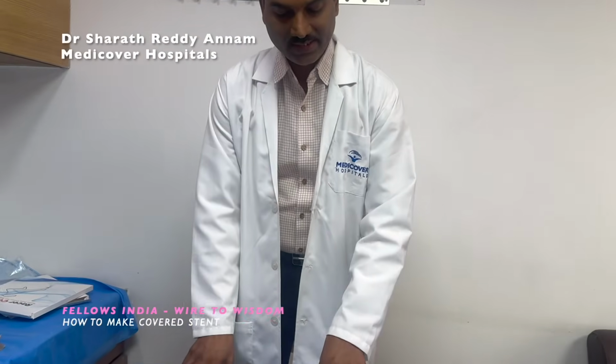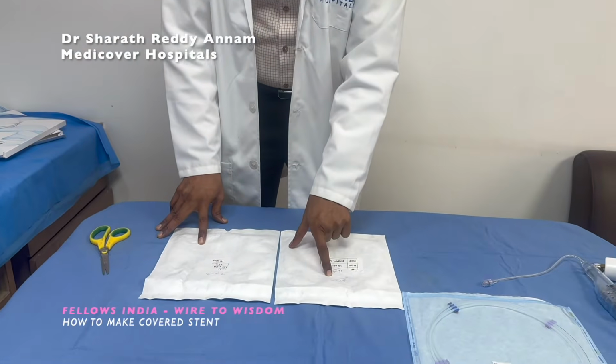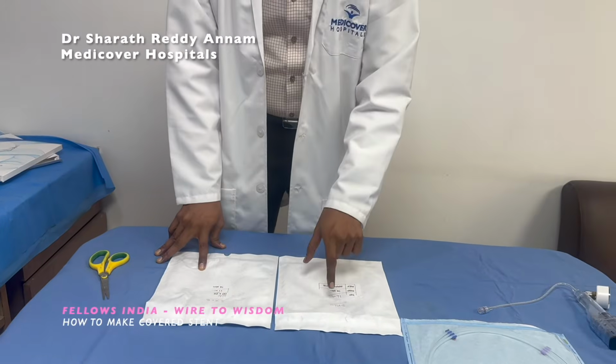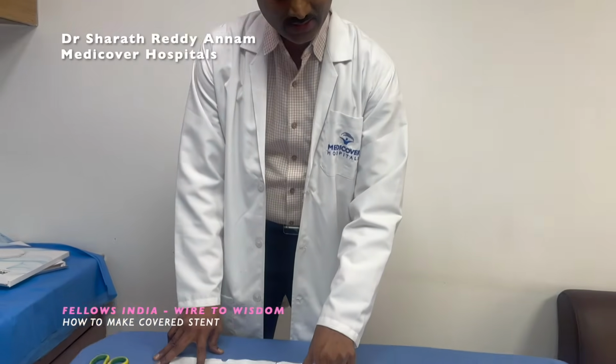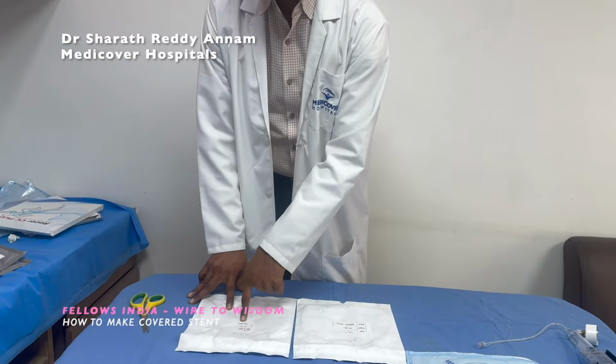So the idea is you have two stents. One is 16mm, another is 28mm. The 16mm stent is used as the covering layer, and the 28mm stent is used as the inner stent to deploy the 16mm. Which I'll demonstrate now.